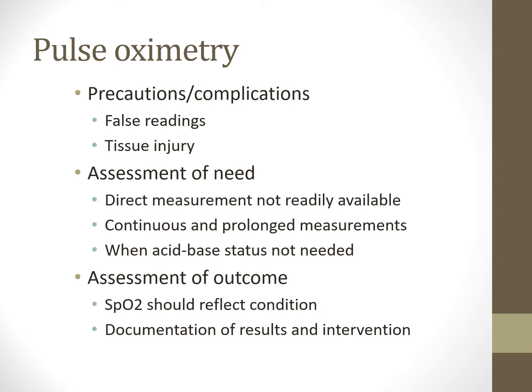This is more common in more generationally advanced individuals and/or really small preemies, where they can get some sort of tissue injury or necrosis if it's too tight. Right, just like with anything else, they could have skin issues and things like that. Assessment of needs. So direct measurement is not readily available.